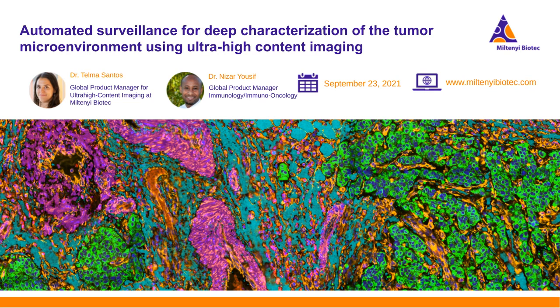That is again a great question. I think that if we have in the audience people who are used to dealing with FFPE fixed tissue, we all know that autofluorescence can be a pain in some kinds of tissue, specifically like the lung or even the brain. So there is an initial step when we do the run that will do a long photo bleaching to ensure that the autofluorescence is removed.